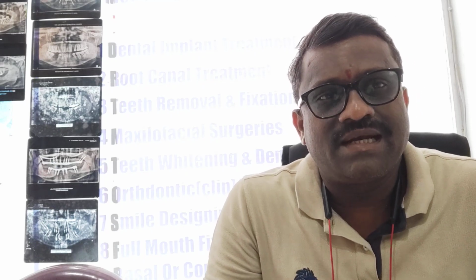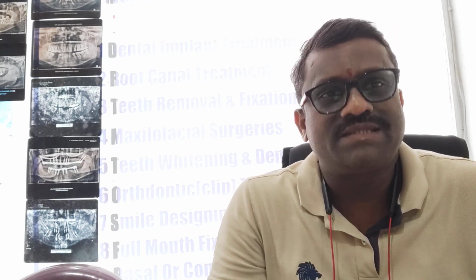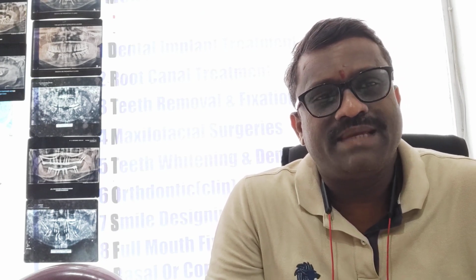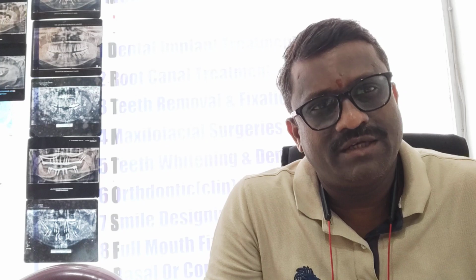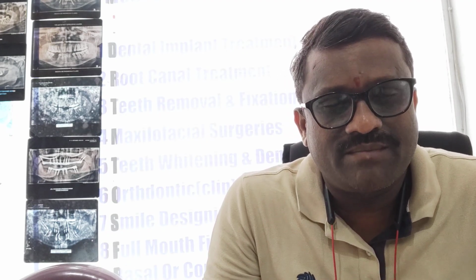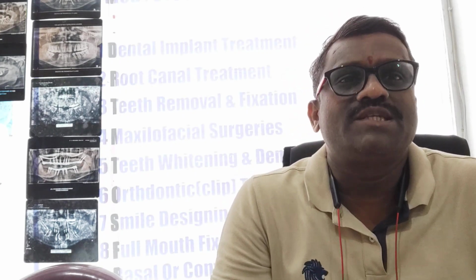That is the single drill technique, whereas in the two drill technique, after the pilot drill you use a 2.1 drill or 2.3 twist drill. If you are going to place the BCS implant, usually a twist drill will be used. If you are going to place a rough surface implant, a conical drill will be used in basal implantology. So we use only limited steps in basal implantology, that is the one drill technique or two drill technique. Then we go with the placement of the implant.